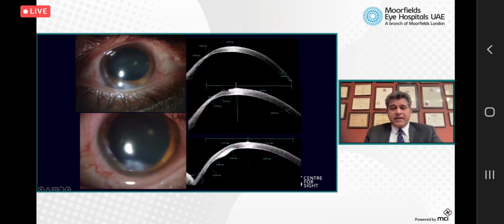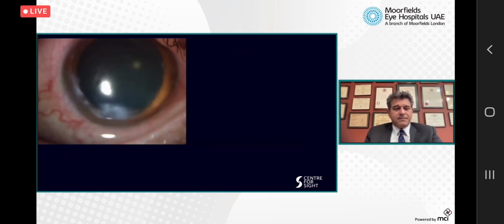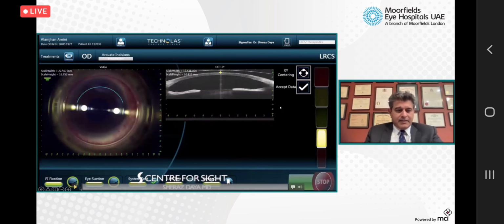You can see the OCT here. It's sequentially very, very thin: 300 microns, 280 microns, 290 microns, 240 microns. And then you can see the area of recent hydrops that was healing. This represents this area right here. So this is the video of the procedure. We used astigmatic keratotomy cuts, and what we did was basically tram lines. This is the old VICTUS software. And let me go back.